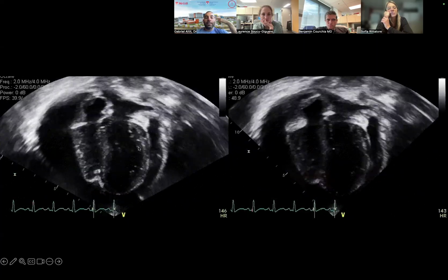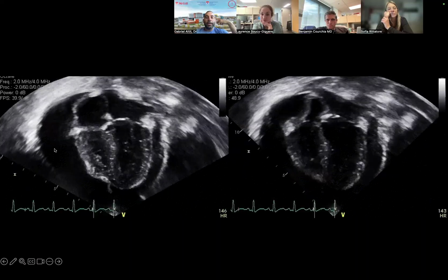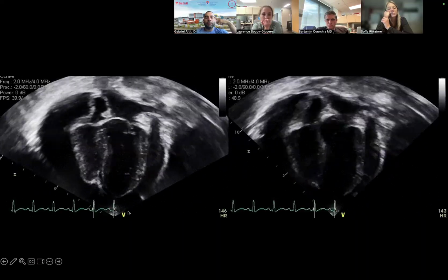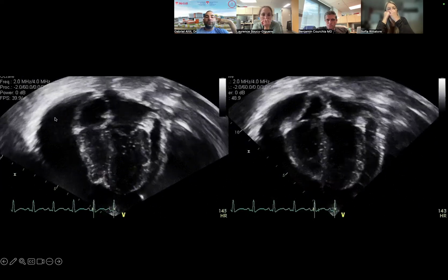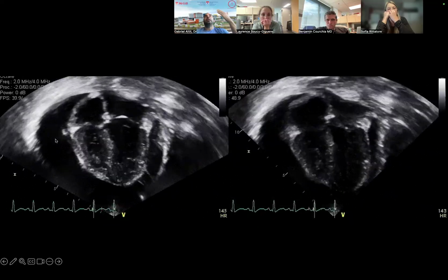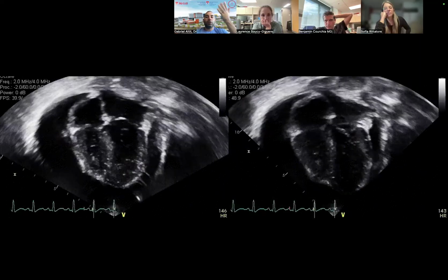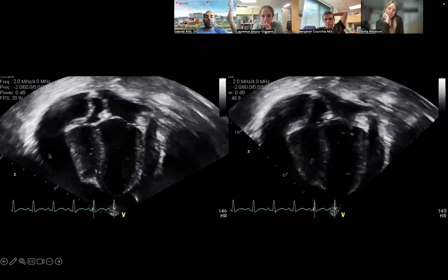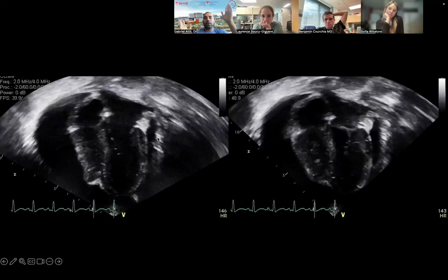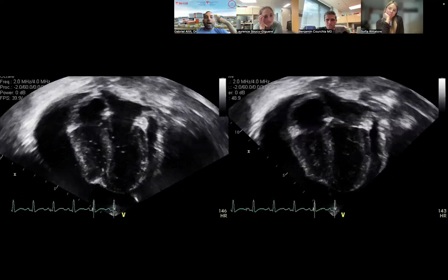So that's a clear example of a pericardial effusion. As you know, fluid is typically anechoic on ultrasound. This is a subcostal or apical view. When it's circumferential, think that your baby is lying flat most of the time, supine, so fluid will accumulate by gravity towards the back of the patient. When you start seeing this all around the heart, it means there's so much fluid accumulating everywhere, right? Because this kid is not standing.